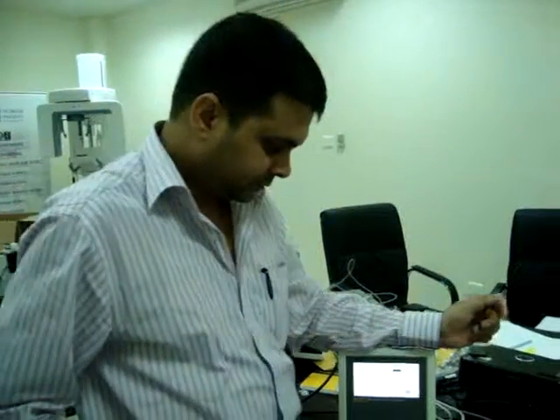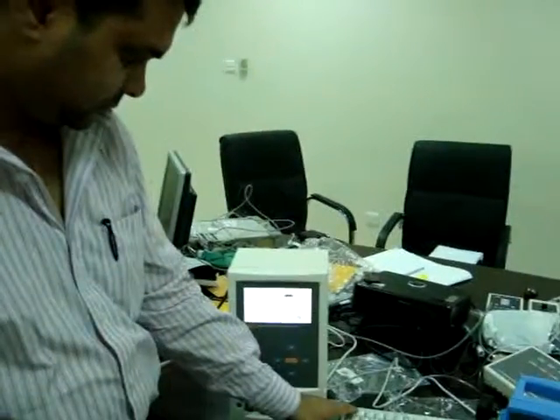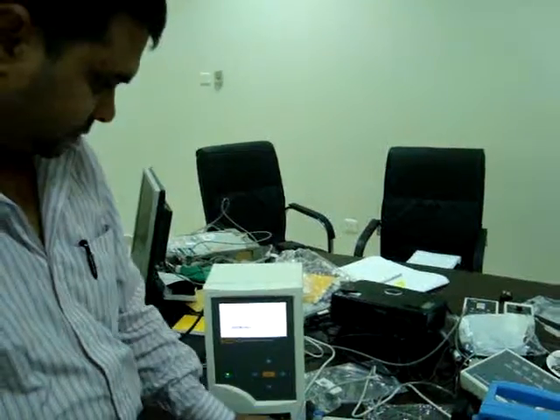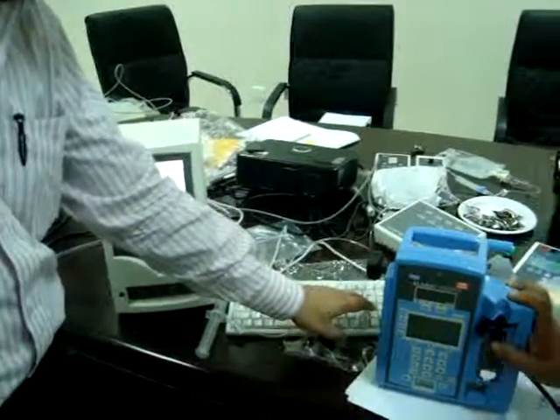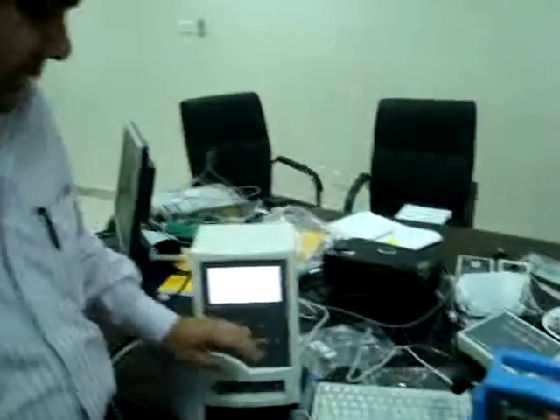So this is the secondary flow. Then you decide how much secondary flow to do. So these are the parameters we set, and then connect and measure.